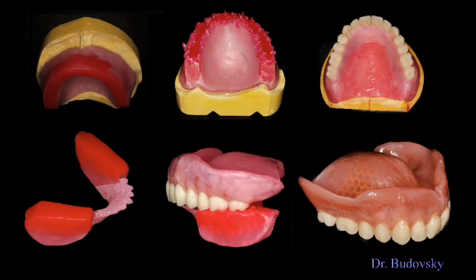And again, at the stage of manufacturing a new denture, we must check a new jaw ratio again. The fact is that temporary prosthetics serves us not only so that the patient can smile while we do permanent prosthetics. Temporary prosthetics is a very important stage which allows us to level down some of the patients' problems.